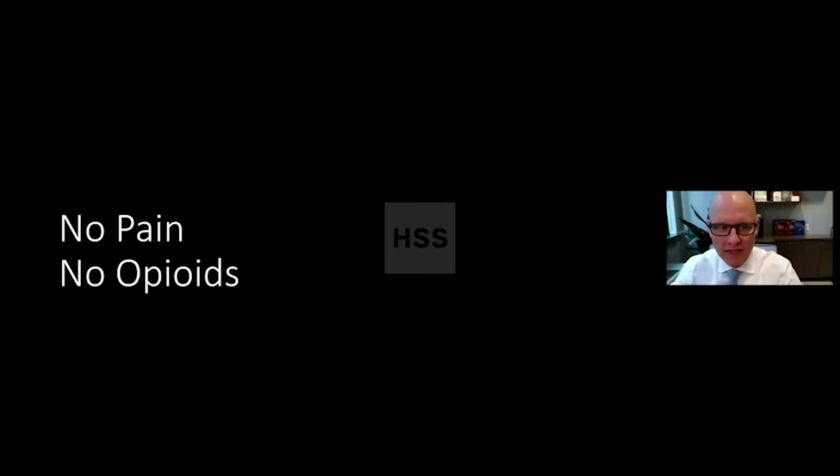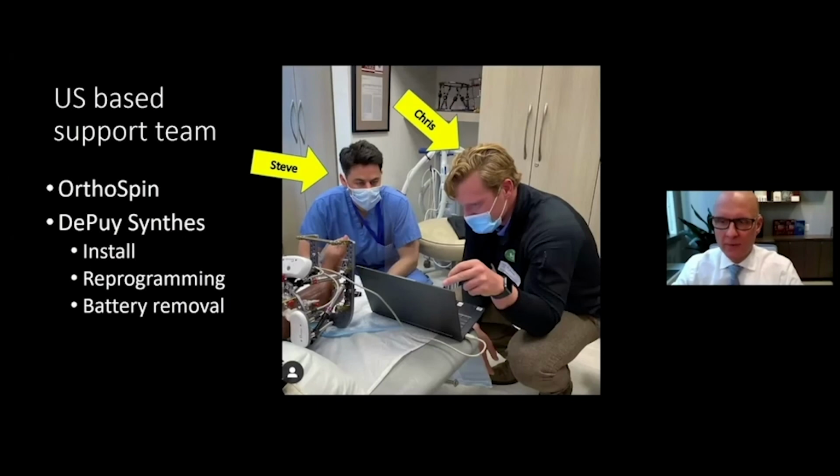Again, this guy had no pain, took no opioids. So, you know, I think there's a lot that goes into the formula of how much pain people are expected to have. I think this is more of the mechanical side of that. And with X-Fix, right, which is the most painful method we use to correct anything, yet this seems to be a good avenue for reducing pain.